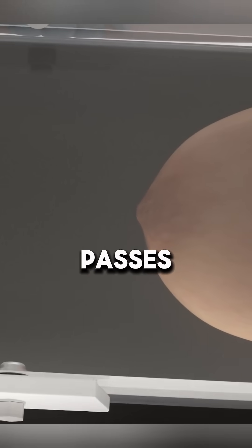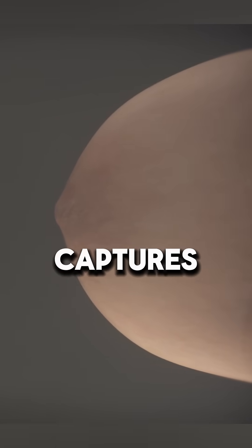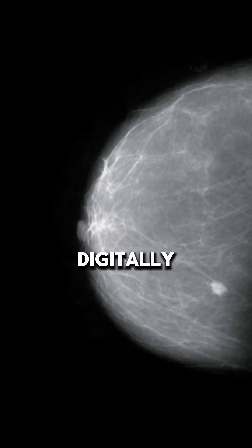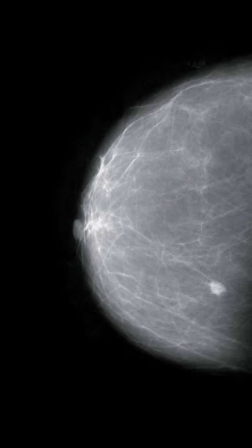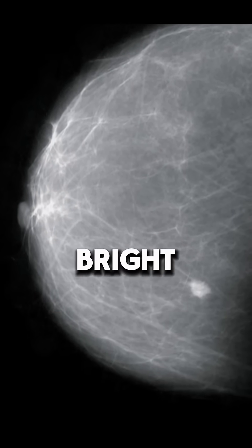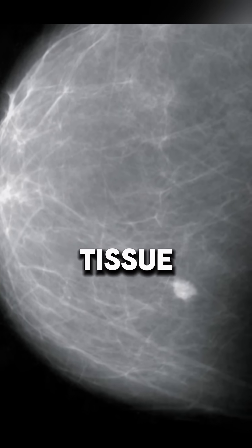As the x-ray beam passes through your breast, it captures an image either on film or digitally. Dense tissues like cancer or calcifications appear bright white, while less dense tissue, like fat, appears darker or gray.